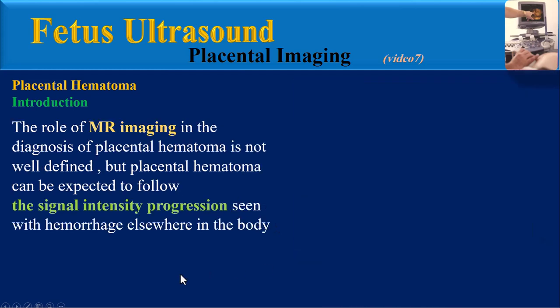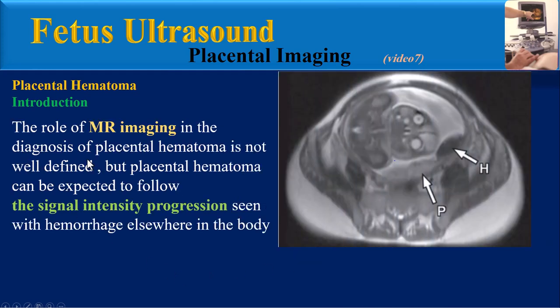The role of MR imaging in the diagnosis of placental hematoma is not well defined, but placental hematoma can be expected to follow the signal intensity progression seen with hemorrhage elsewhere in the body.